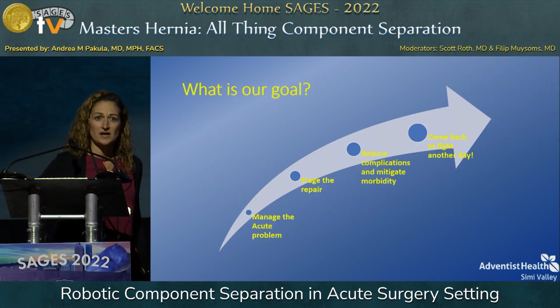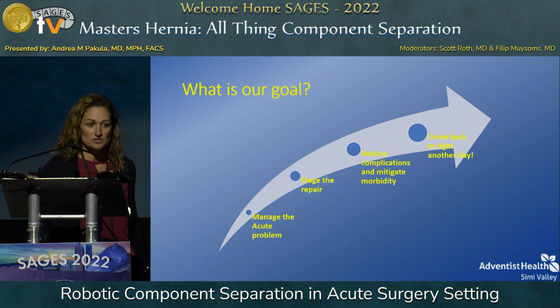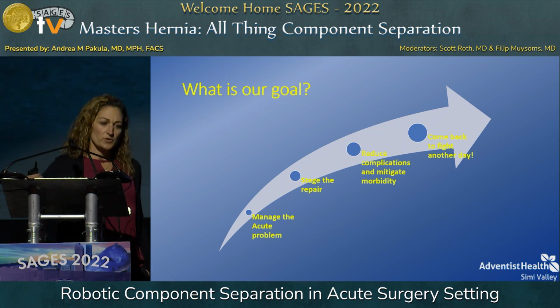So what is our goal as hernia surgeons and/or acute care surgeons? First thing we need to do is manage the acute problem. Oftentimes what we'll do in this setting is we're going to stage the repair.